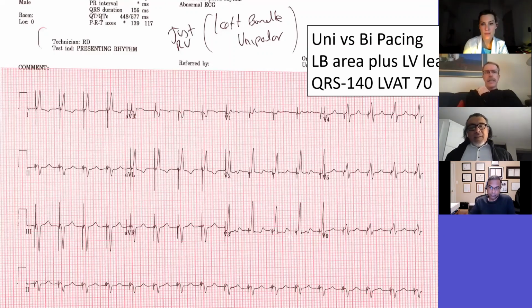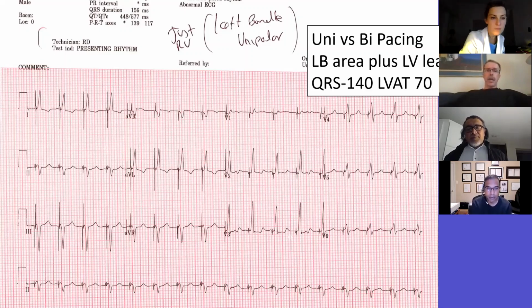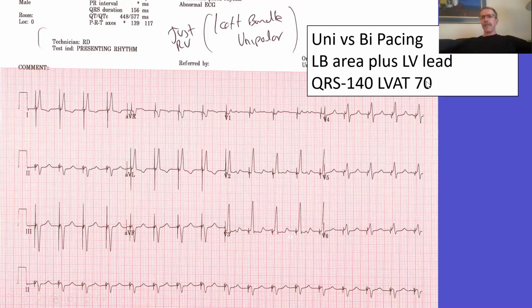So this was a case where a patient with LV dysfunction had a heart block, and so we did a CRT, and the CRT had this 175 millisecond wide QRS. His junctional escape was 140 milliseconds, and suddenly I got a 175 millisecond CRT. So I decided to put a left bundle lead in, this is CRT-P, instead of the RV apical lead.